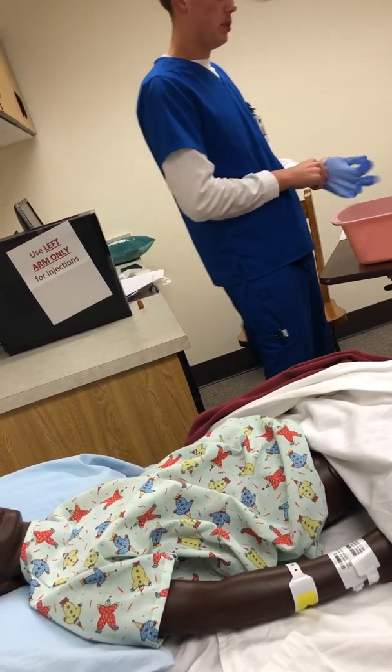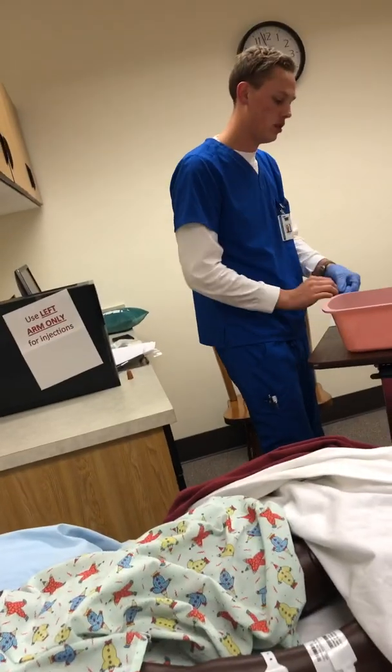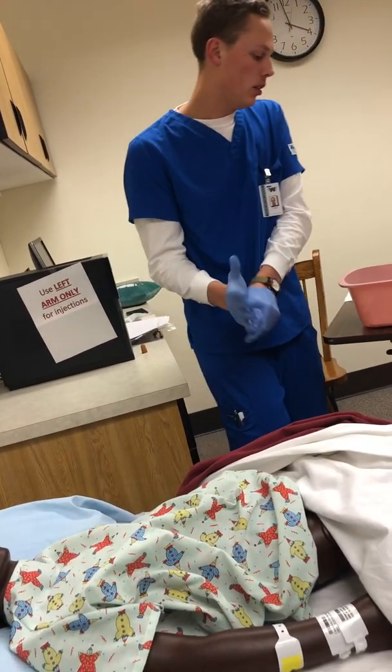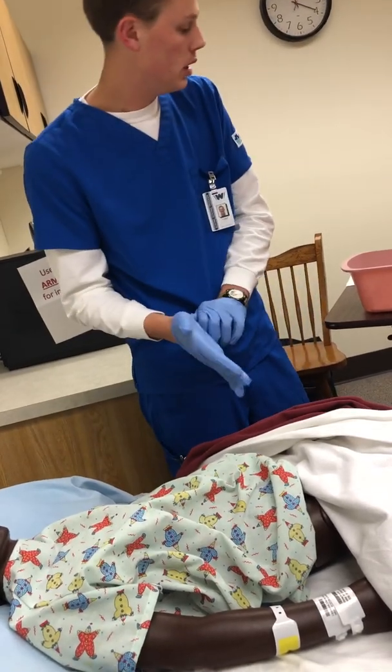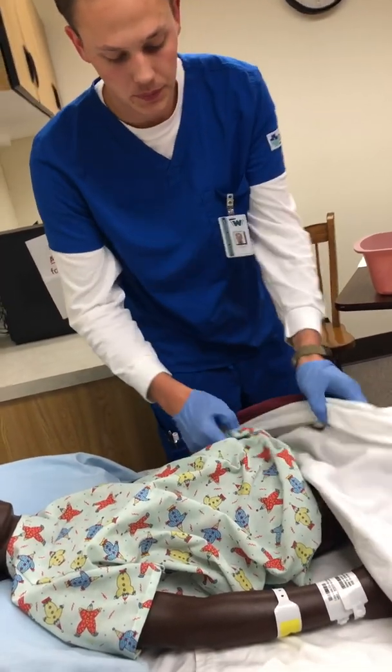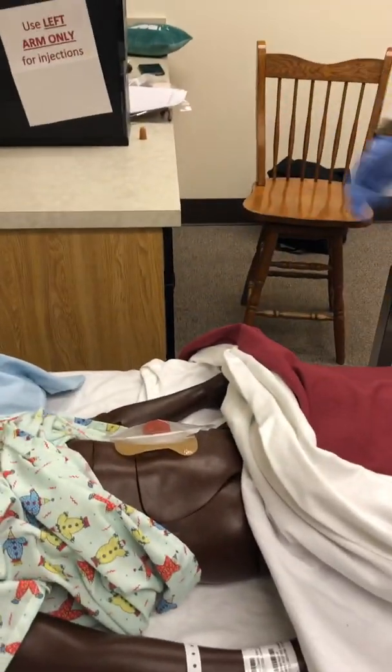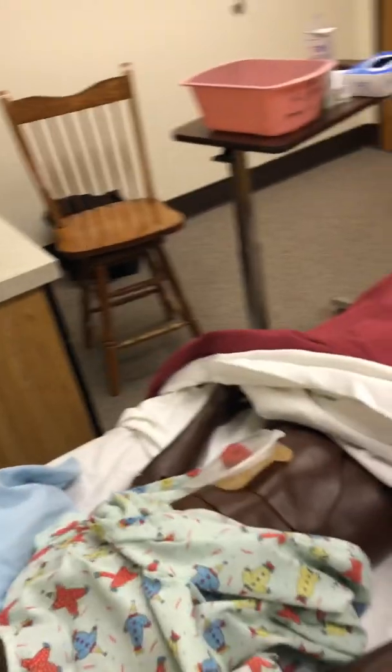So I'll just put my gloves on, ask the patient how they're doing, and then I'll go ahead and look at the ostomy bag, only exposing what I need, and then I'll be needing those chucks behind here.